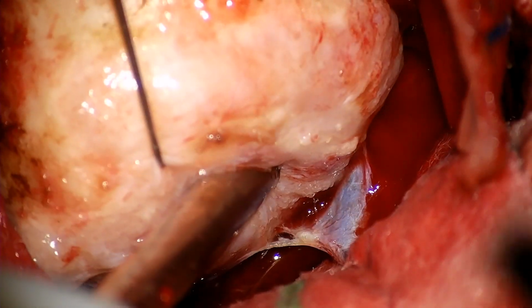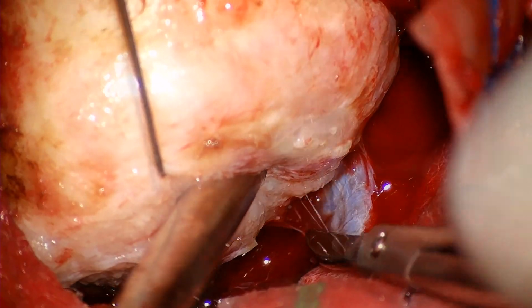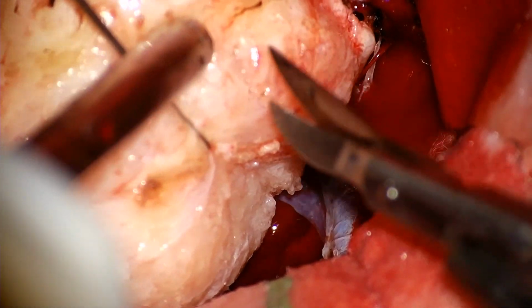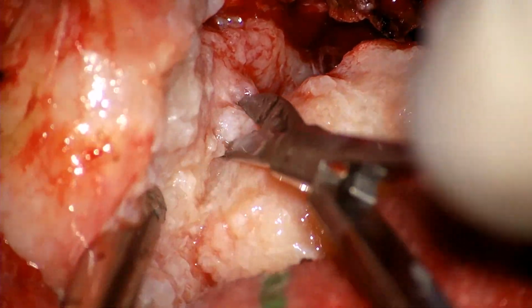See how prior devascularization allows for a clean field? Avoid, in this case, cutting too close to the vein. A sharp dissection of the arachnoid just a quarter of an inch away from the vein is enough to peel the tumor capsule off. At some point, the tumor is too large to see under this vein, so I prefer to do some debulking.